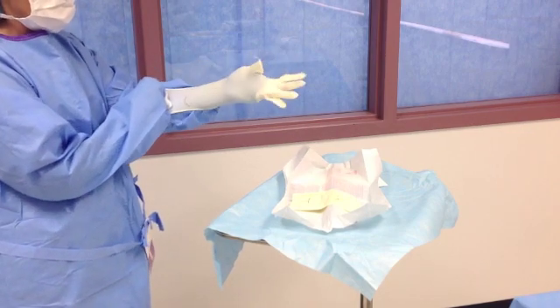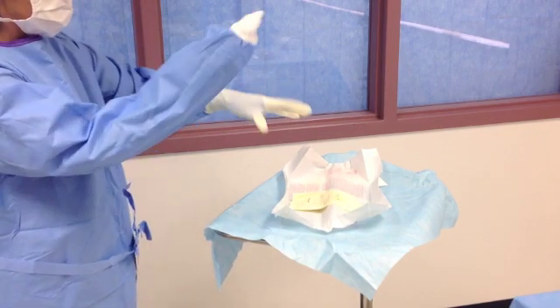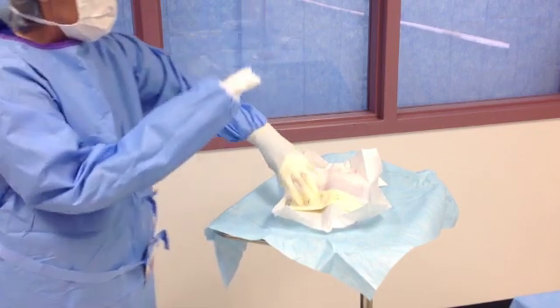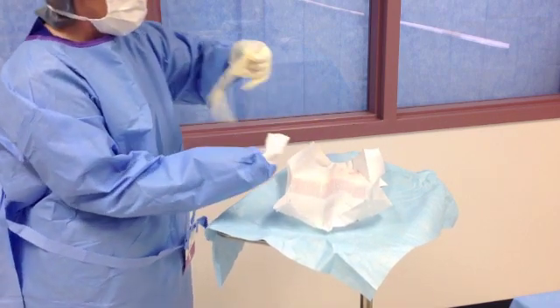Using your right hand, grasp the top side of the cuff and pull it up and over the hand and then down the arm while extending your fingers into the glove. Repeat to glove your right hand.